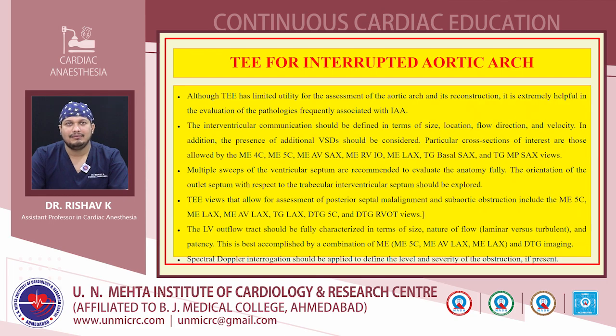However, it is extremely helpful in the evaluation of the pathologies frequently associated with interrupted aortic arch, because interrupted aortic arch seldom presents as an isolated lesion. Often it is a combination of other associated lesions and can present as a spectrum of commonly related congenital cardiac lesions. The interventricular communication should be defined in terms of size, location, flow direction and velocity.